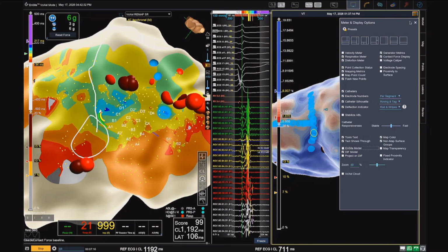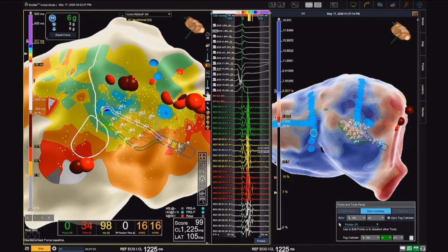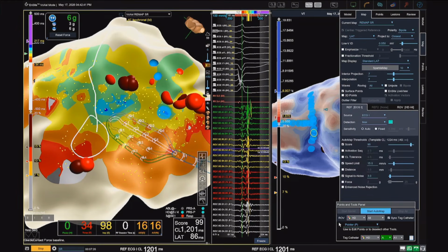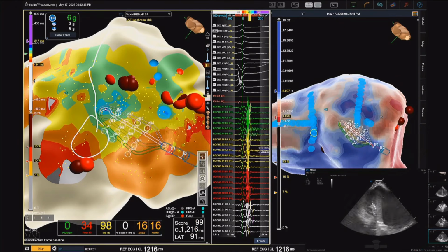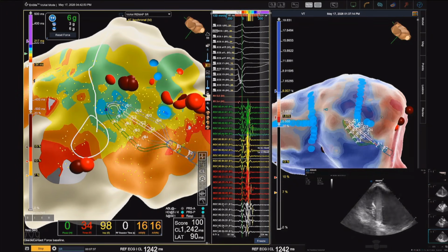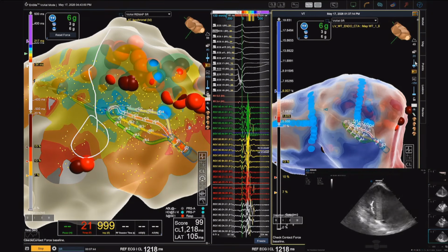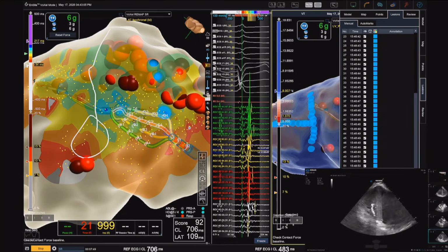So it's a typical example where despite having a nice map and a nice CT, the main problem is the lesion size you can get with a catheter. It's just in the middle of the channel where we have not ablated yet. Is that right, Maria? And there's another factor: if you look at ICE, keep it there. Maybe it's visible on ICE that you're just in the middle of the papillary muscle. You're inserting it within two heads. I don't know whether you can see on ICE, but generally we are somewhere in the papillary muscle. So it's another structure that somehow prevents you, and a beautiful electrogram.